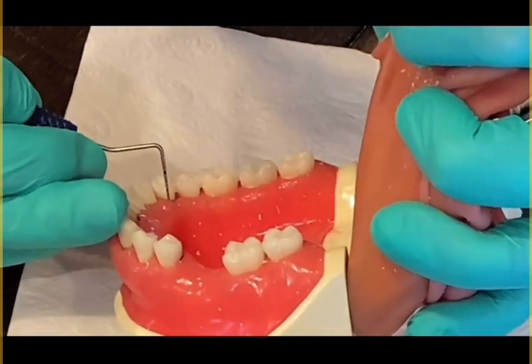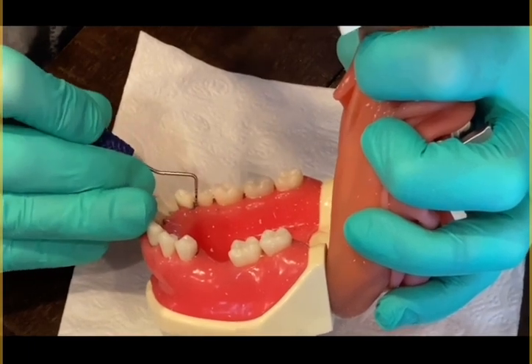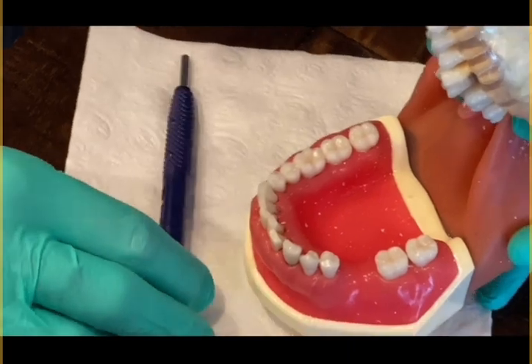4, 3, 6. And then I would go on to the rest of the teeth, and that's how you use the periodontal probe.